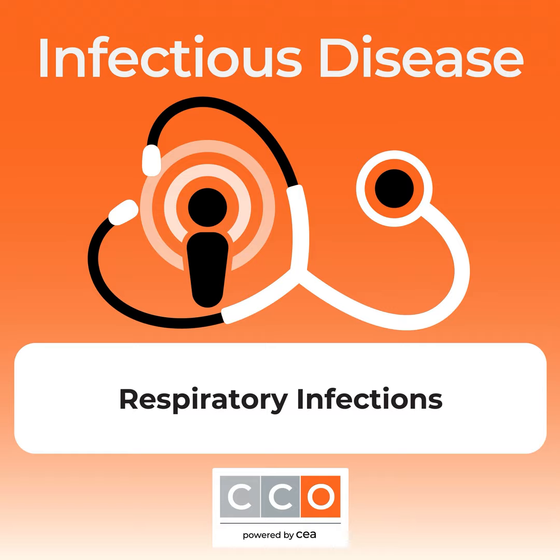It isn't really until you get to greater than or equal to 10 to the seventh copies per ml on the pneumonia panel that more than half your patients are actually going to grow that organism at the quantitative threshold that we usually use in culture. So it's very important to remember this. And so implementation of this test is going to create some clinical conundrums for you as a clinician and the clinical team about how to interpret some of these results. But it's important to expect this.